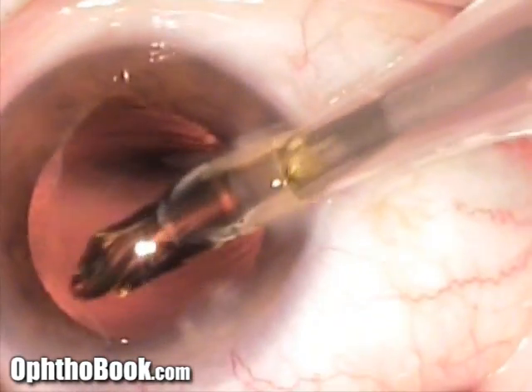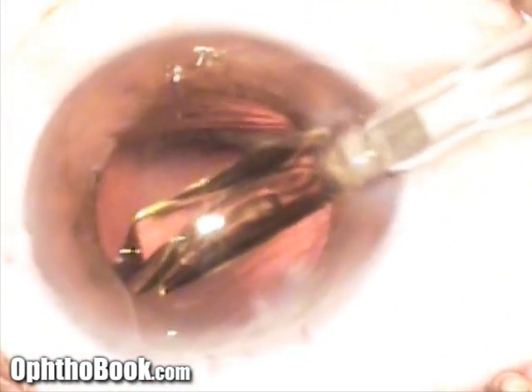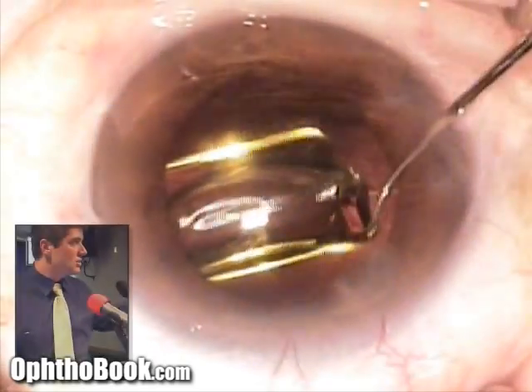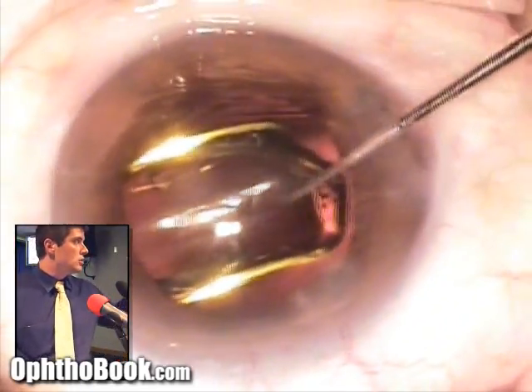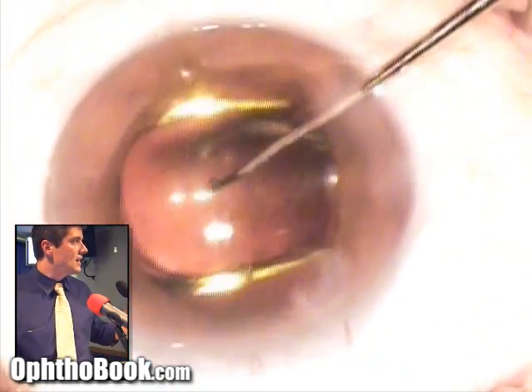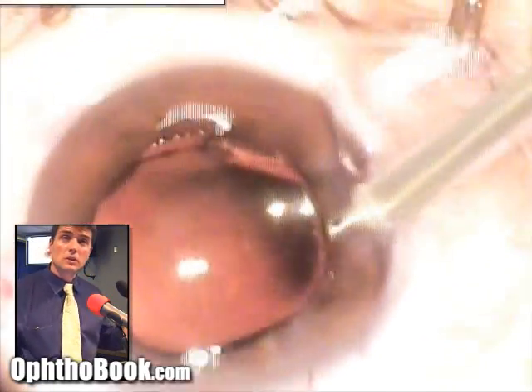We inject the lens implant using a screw-type inserter — I prefer plunger-style ones but this works fine. The lens goes in folded like a taco and unfolds like a flower inside the eye. You can see the edges of the haptics — the little arms — slowly folding out. Sometimes I have to assist them a little because static electricity wants to stick them down. As they continue to unfold, they secure the lens inside the capsular bag in the perfect location.